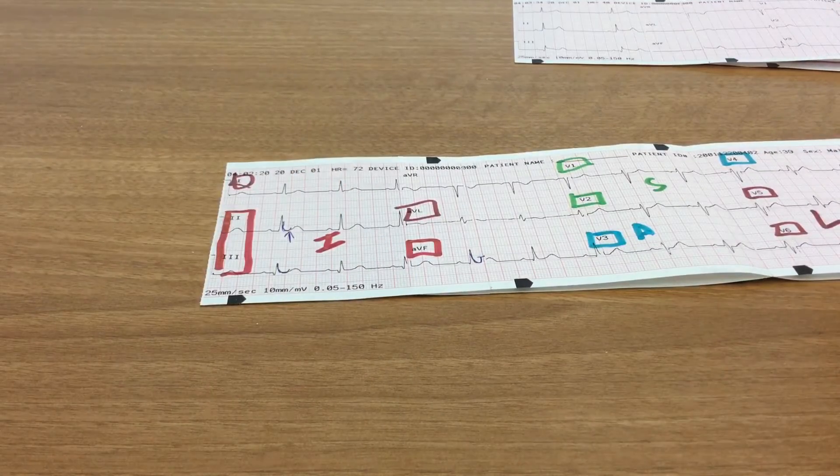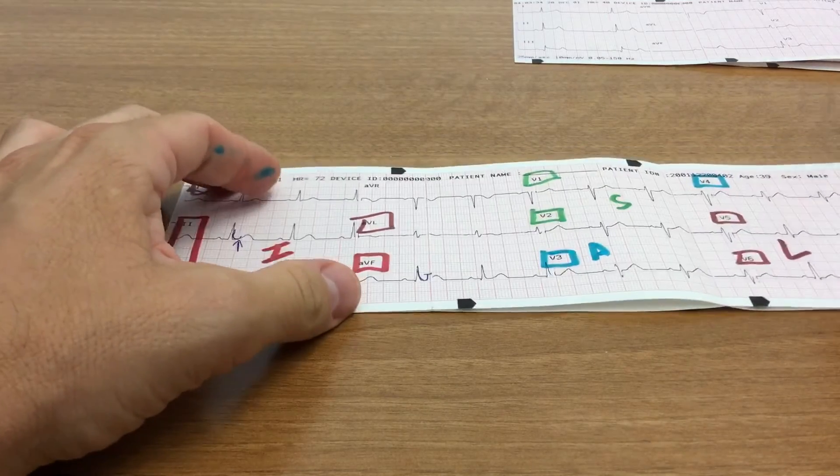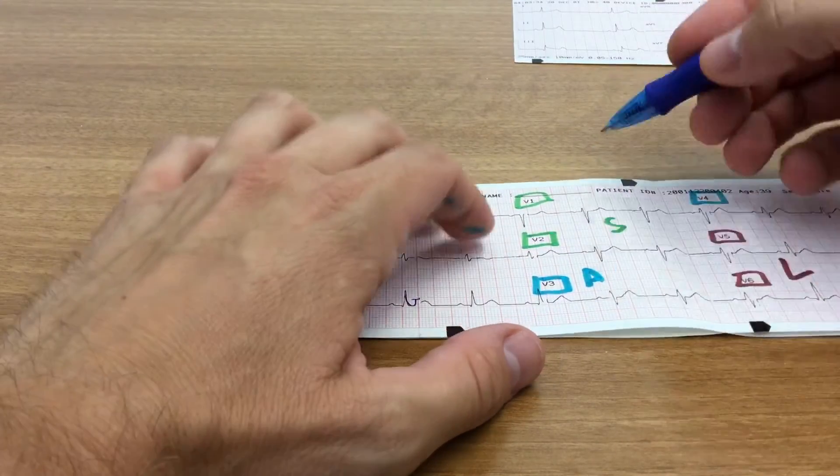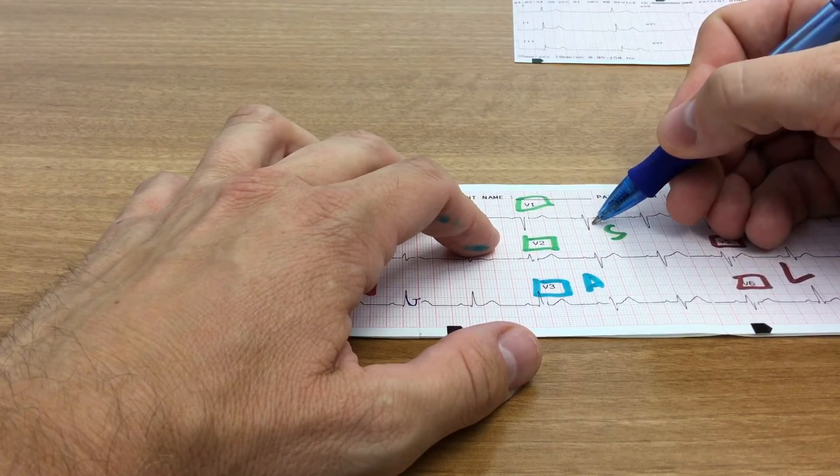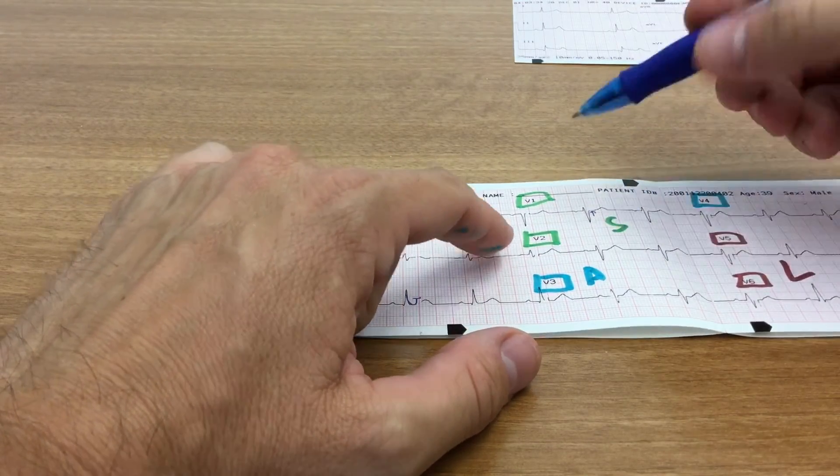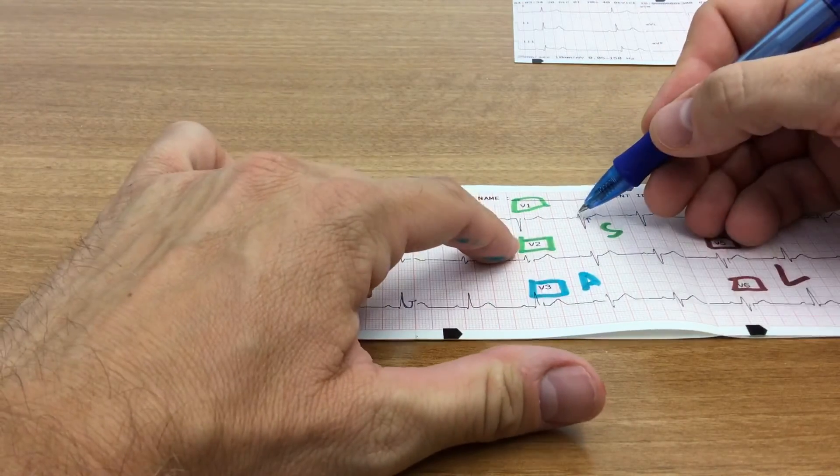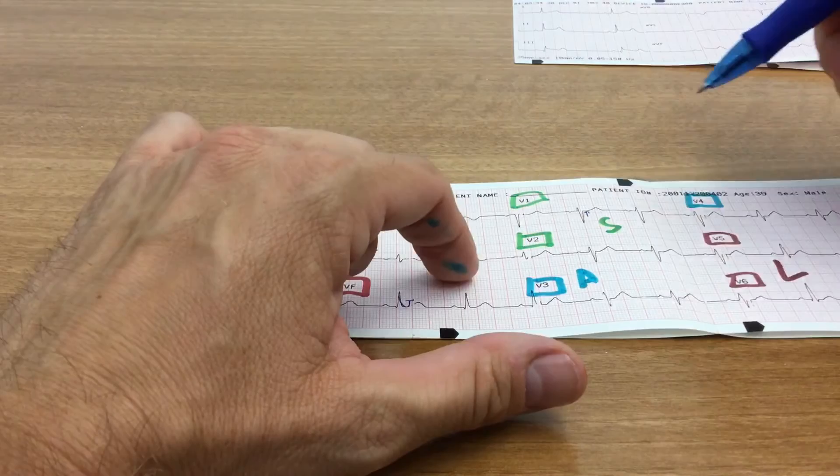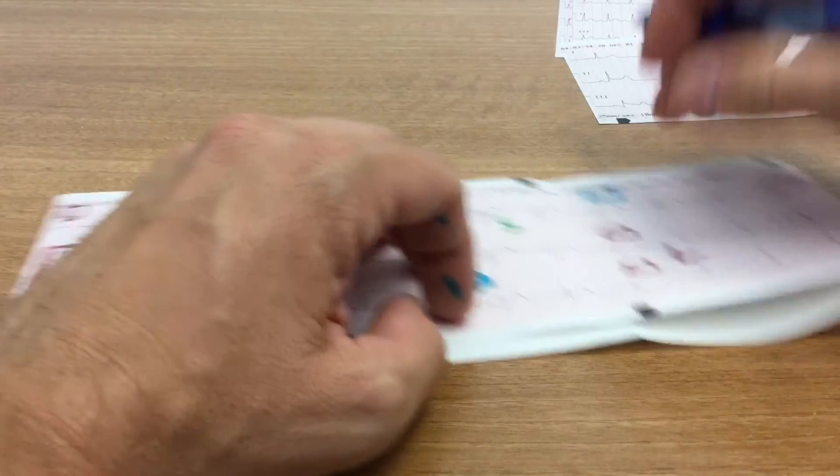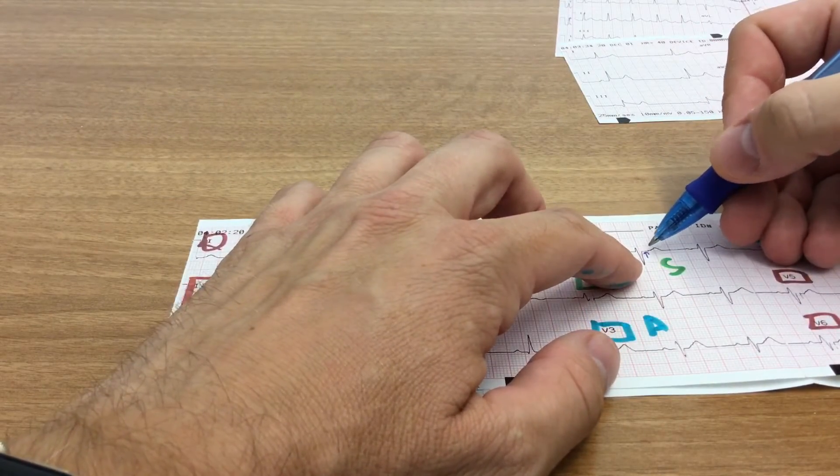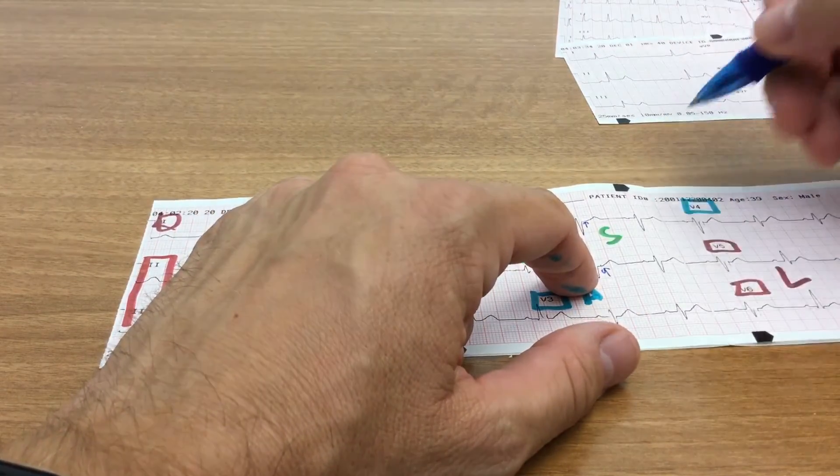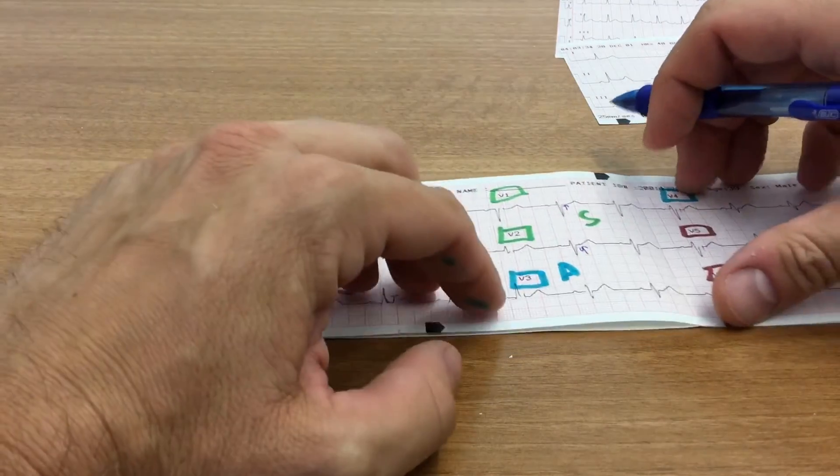So then what I do is I move on to the septal wall, S, septum. So V1. So we look at V1, and again, we have a return to baseline here. Now remember, V1, the QRS normally should have this negative deflection. That's normal in V1, and so it's kind of upside down to how you'd normally look at it, but that doesn't really matter because you can clearly see that I have a return to baseline here. And then V2, the same thing. I have a return to baseline here, so the ST segment checks out. So the septal wall is okay.